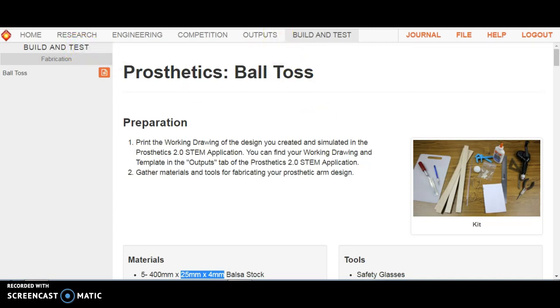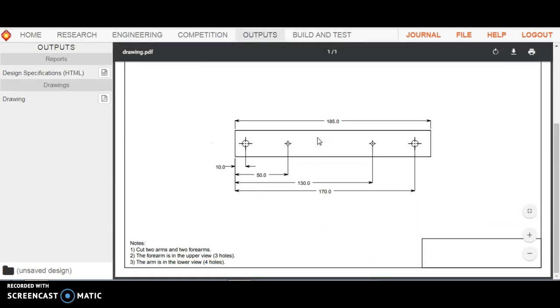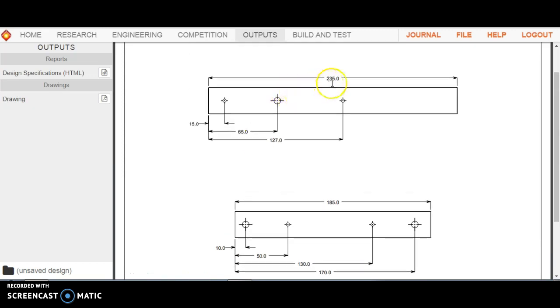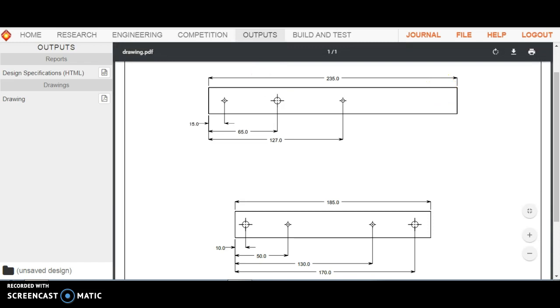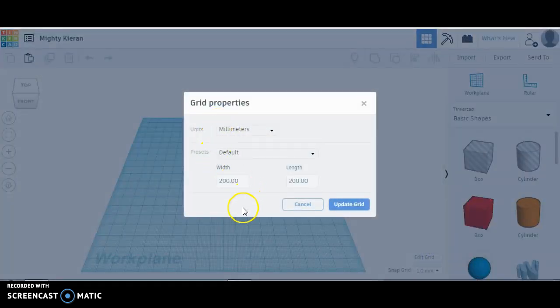Okay. So the first thing I notice is that my upper arm, let's see, the forearm is the upper view and the arm is the lower view. So I guess my forearm here needs to be 235 millimeters long. So I know from using TinkerCAD a good bit that this grid is only 200 millimeters long as the default. I'm going to change that to 300 by 300 millimeters.